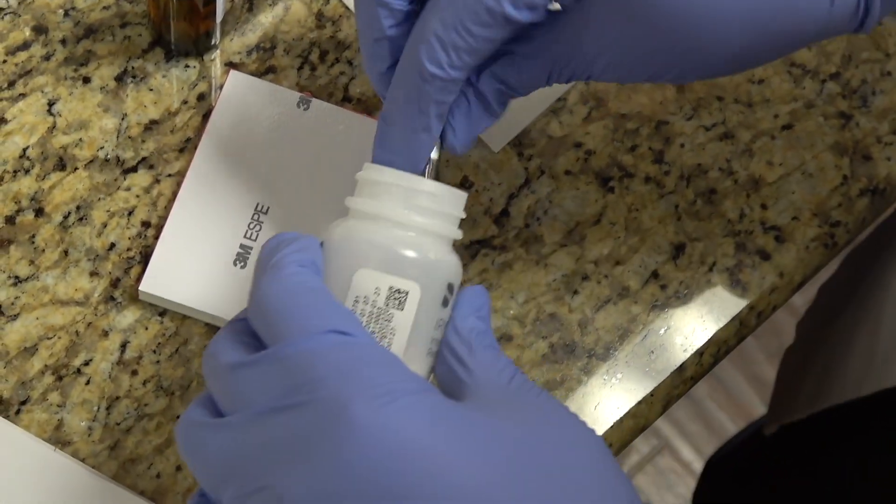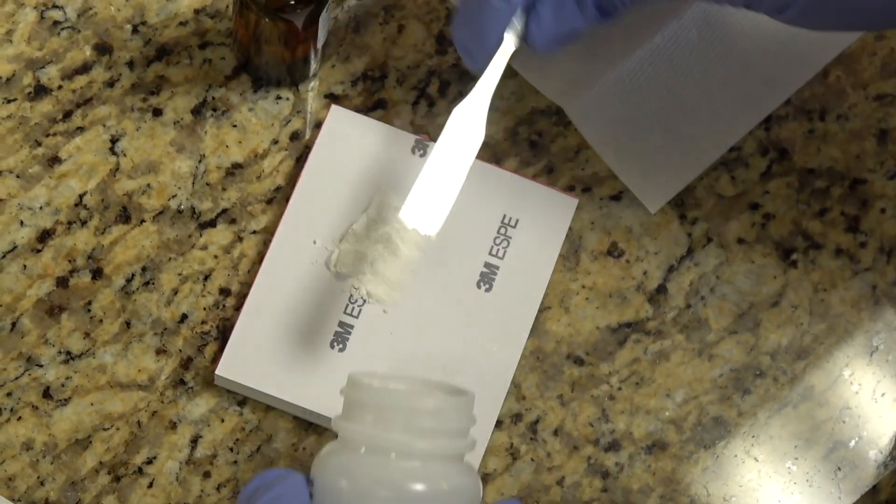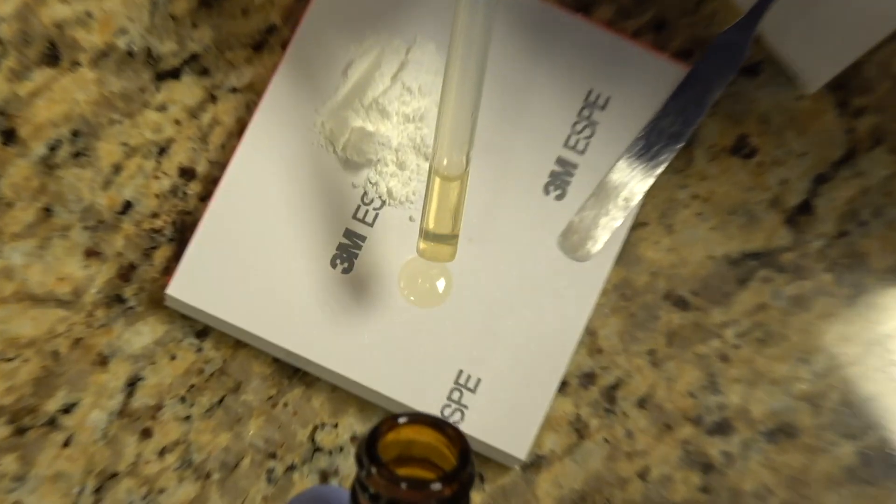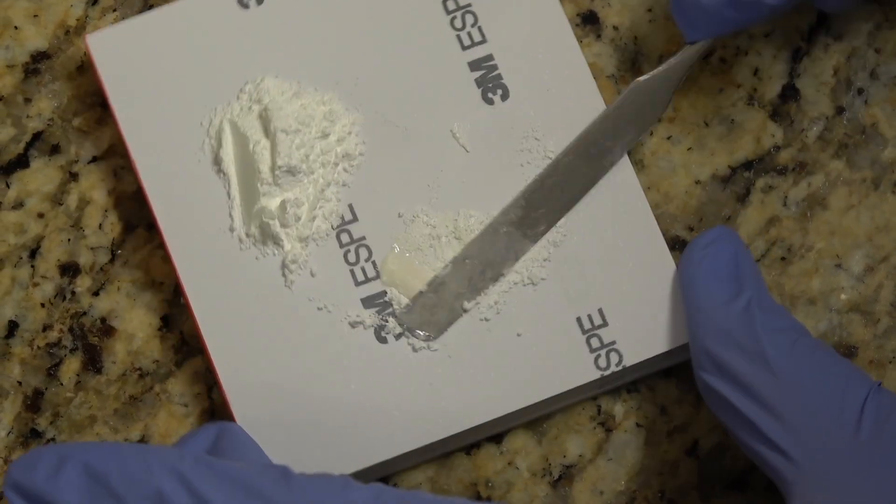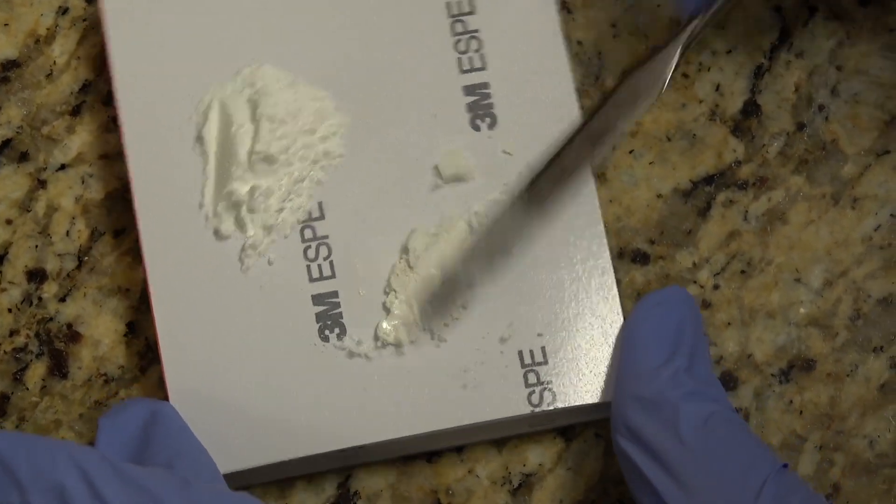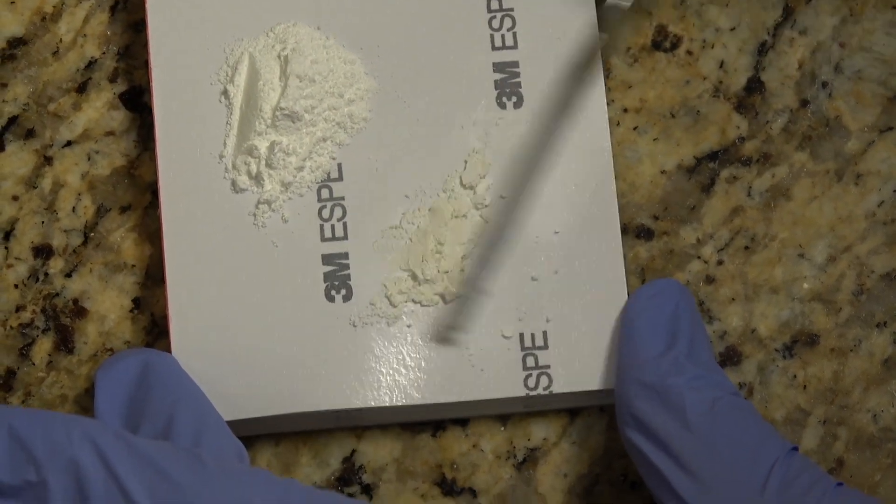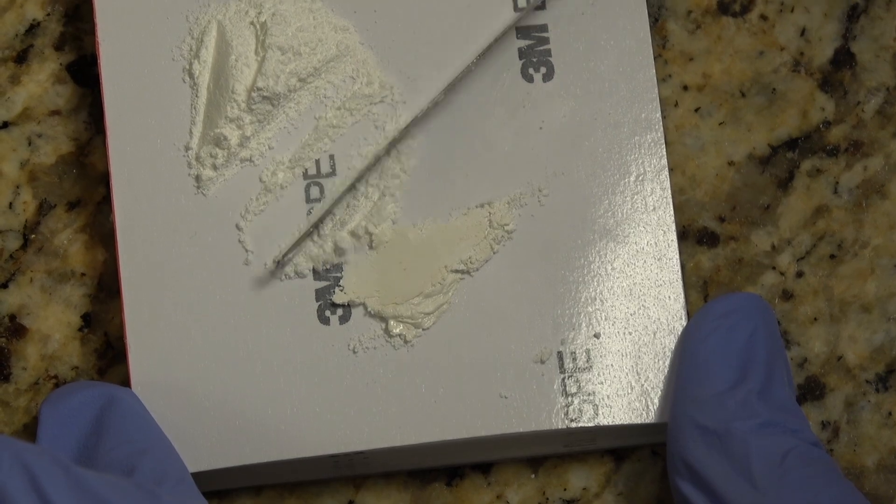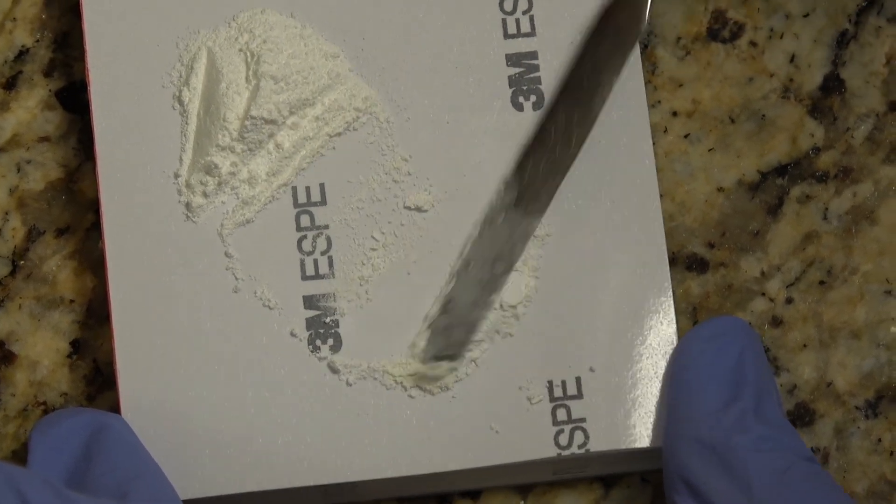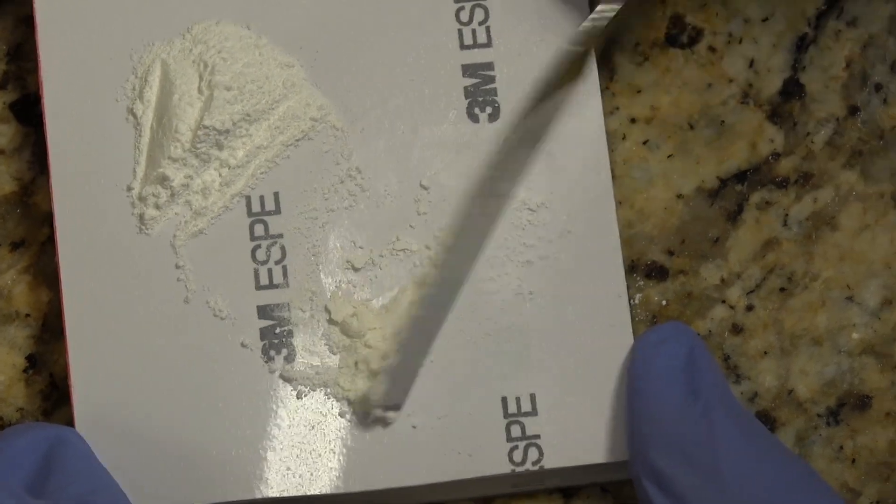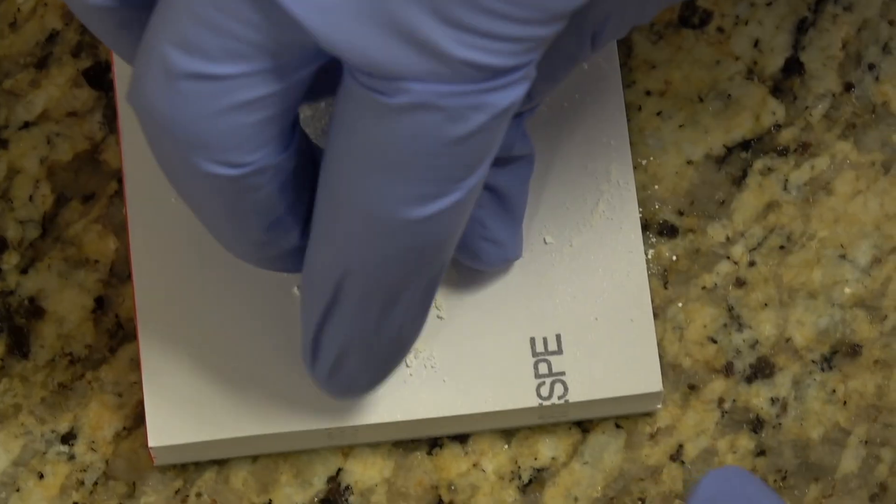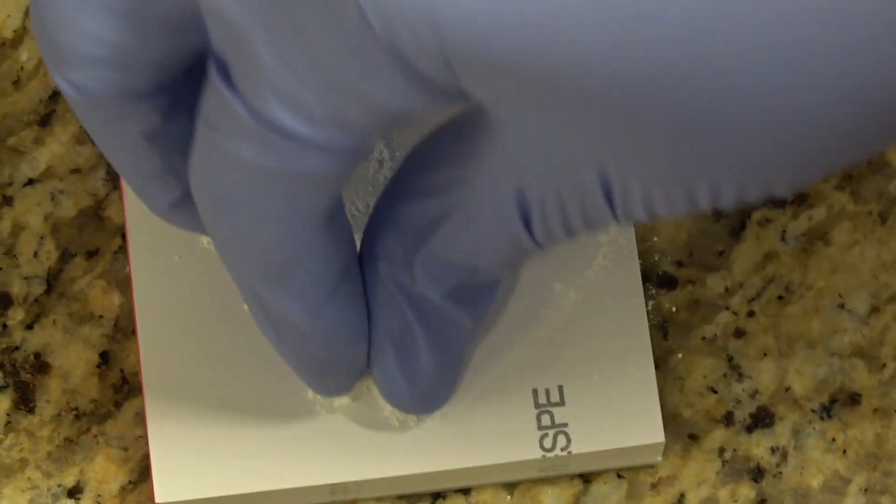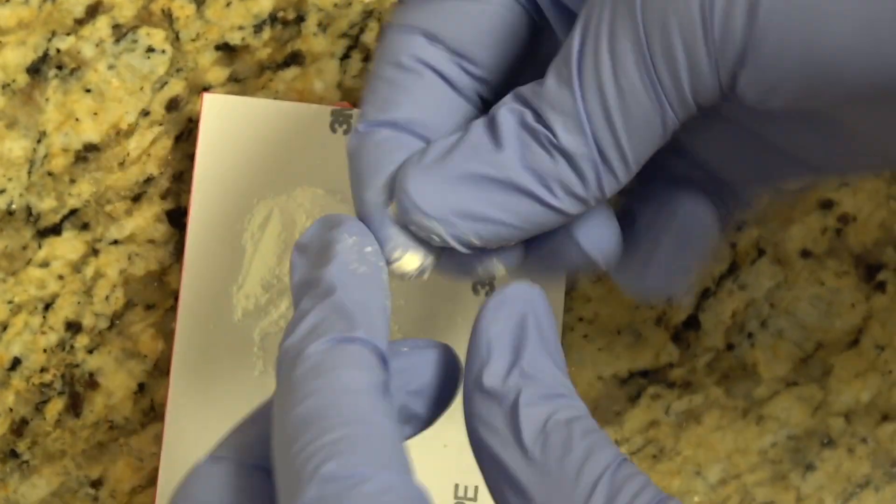Now this is IRM and you mix it dry. First you spatulate it. And then you take your fingers, your glove fingers, and you squeeze the part you've spatulated into the powder so it's pretty dry and pretty firm.